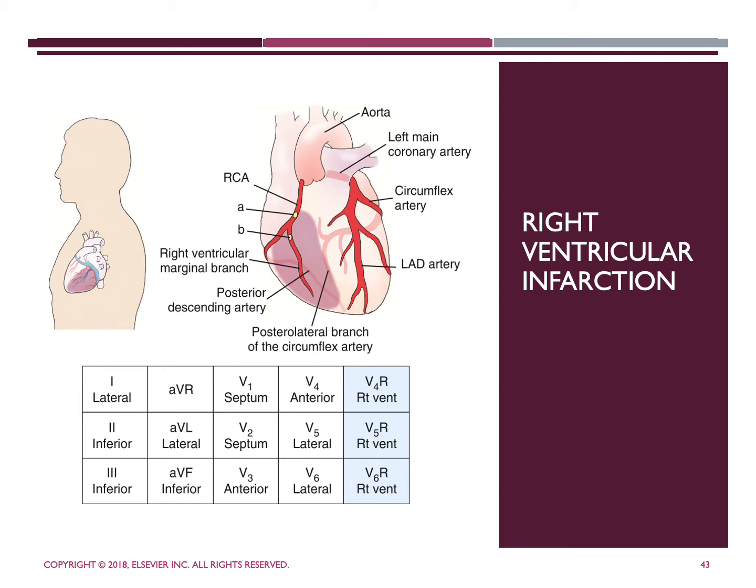Right-sided chest leads should be used to help evaluate for evidence of an RVI in all patients with inferior STEMI. What should be used is the V4R, which has the highest sensitivity.